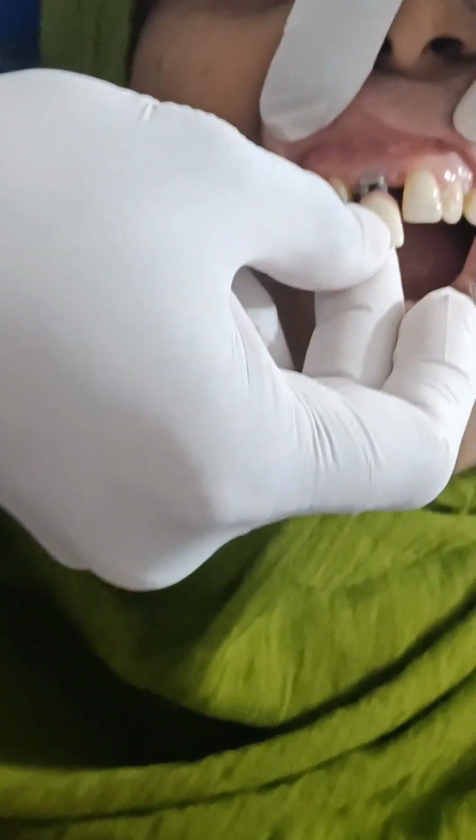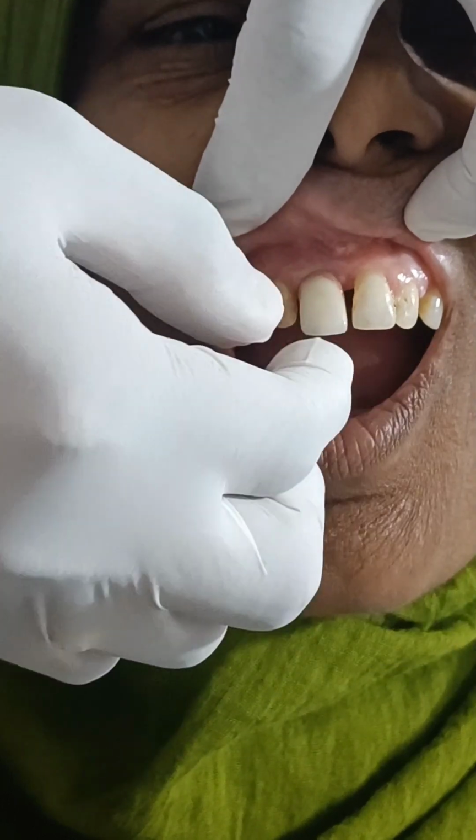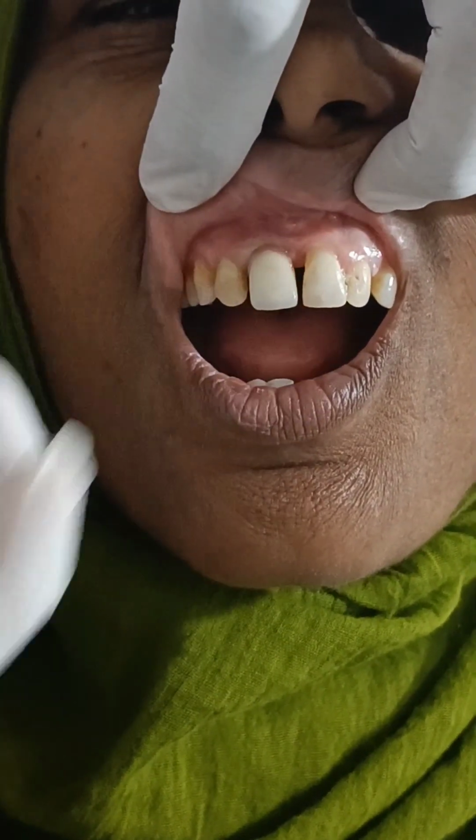Okay, so this is how it fits. Perfect. Slight mismatch in the shade, but it's okay. It looks fine with the patient.